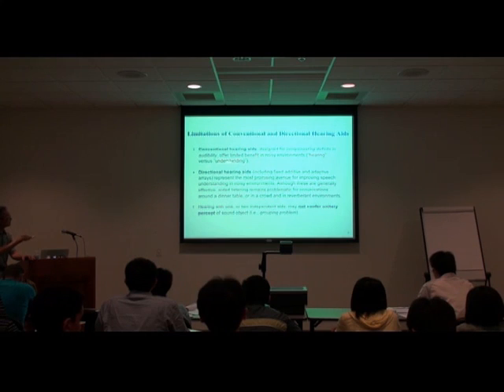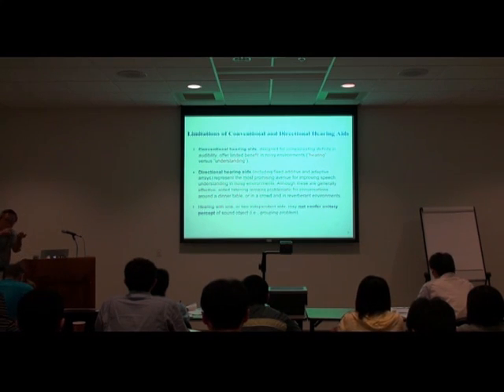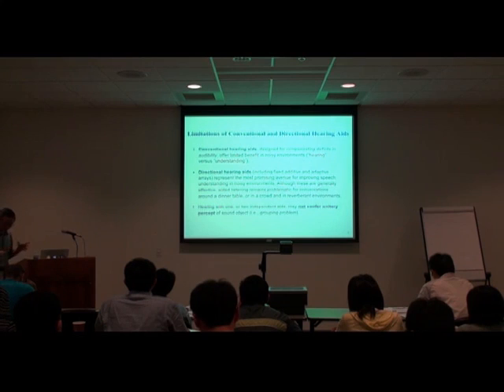So to provide some relief to this particular problem of inability to understand, people have designed directional hearing aids by putting a directional microphone, and sometimes they even design fixed or adaptive arrays by putting an array of microphones either on the chest, headband, or whatever.